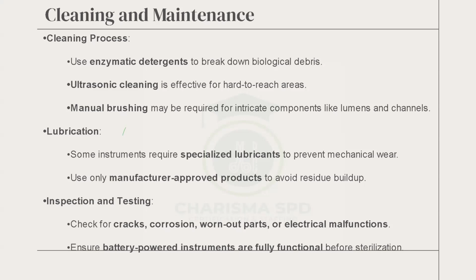Okay, this surgical instrument comes with different attachments. Each attachment has its own sound. So as you work with them, you get used to it. Don't be scared by all this gazillion of information I'm giving to you. Just listen, read after this, and when you get to the department, the rest of it will be taken care of by your experienced senior staff and the manager. They will teach you how to navigate around all this information we are giving you.